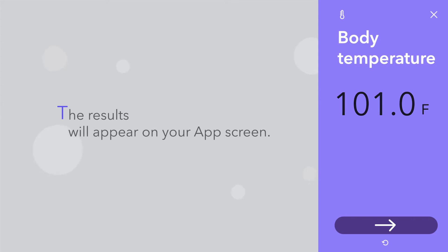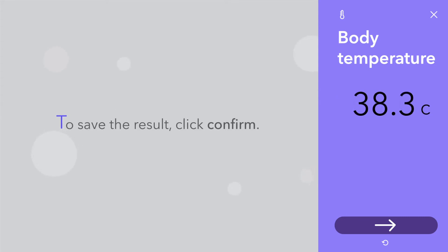The results will appear on your app screen. To save the result, click confirm.